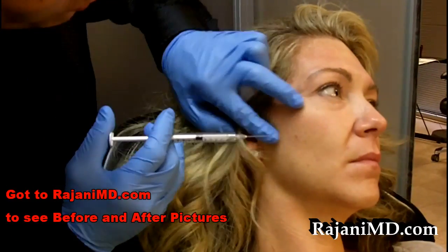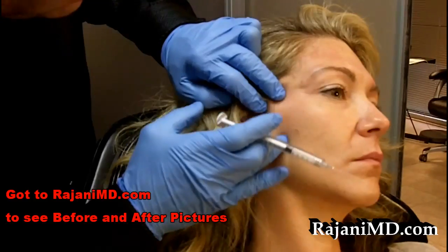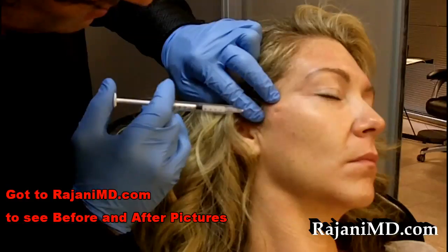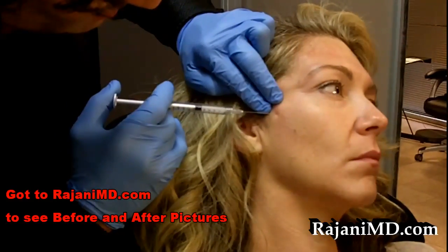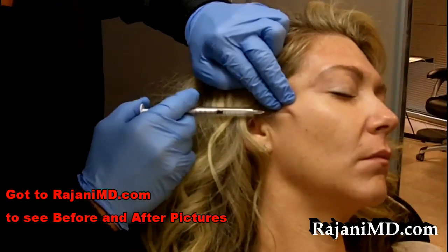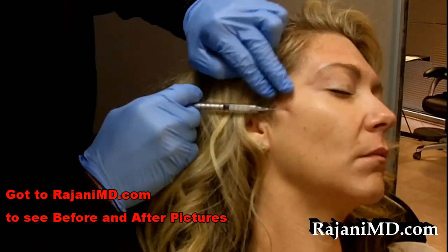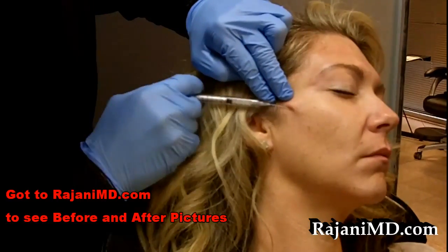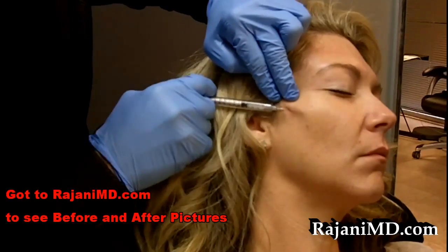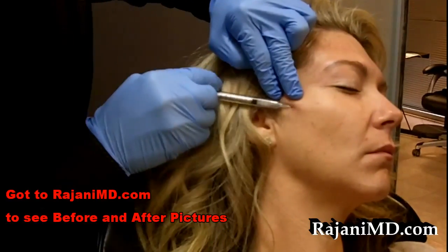I'm using the micro cannula — this is a 27 gauge. I'm using Bellafill, and you can use a 25 gauge; most people would prefer that. But if the patient has had other collagen stimulators or any surgical procedures done, the 27 gauge just cannulates and navigates a little bit easier. The 27 will however act a little more like a needle than the 25. I'm going back and forth putting micro lines of product here. Another great product for the high lateral cheek that provides a nice lift is Voluma, where I use a 27 gauge needle.